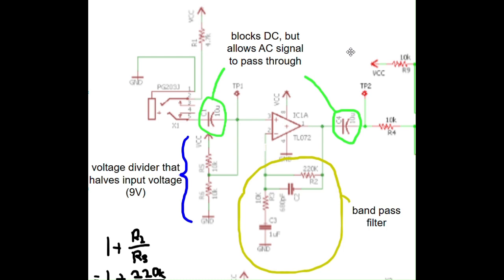So let's take a look at block 1 of the circuit. It revolves around the op-amp TL072 and as mentioned is a closed-loop non-inverting amplifier. The coupling capacitors C1 and C4 both block DC signal but allow AC signal to pass through. The non-inverting pin is connected to a voltage divider circuit with R5 and R6 both having values of 10K and Vin being 9 volts. That gives us 4.5 volts.